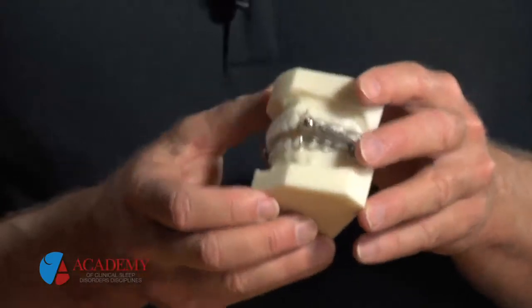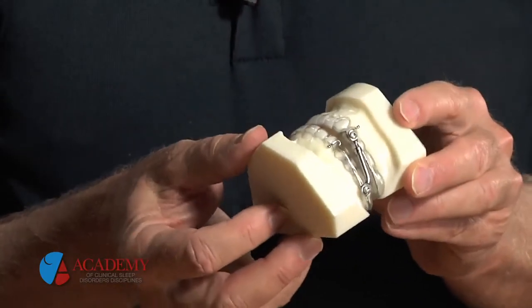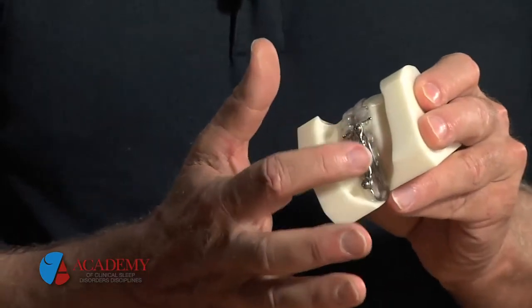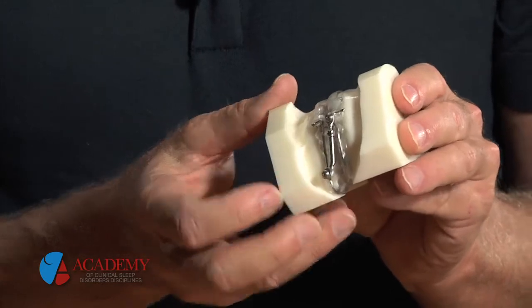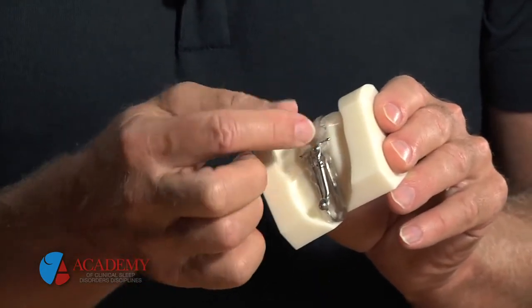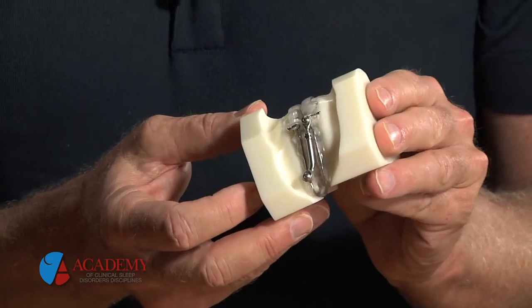There are all kinds of different styles. This one is a Herbst appliance, the same concept. It uses these metal sleeves on the side to establish jaw position and allow advancement. It is one that is currently used a lot for Medicare patients, if you have Medicare coverage, because Medicare doesn't cover all different types of appliances, and this is one that they do, so we use quite a few of those, and they're very effective.